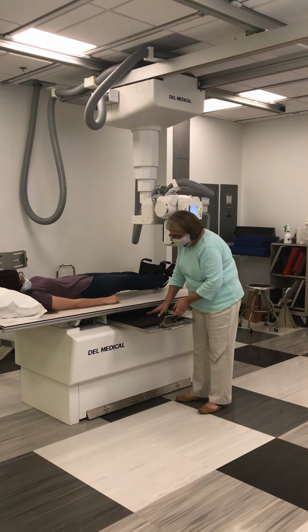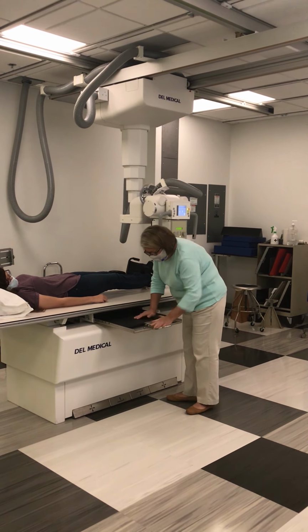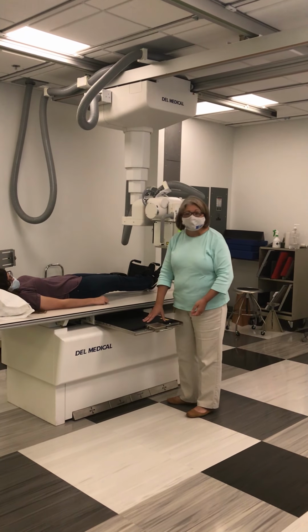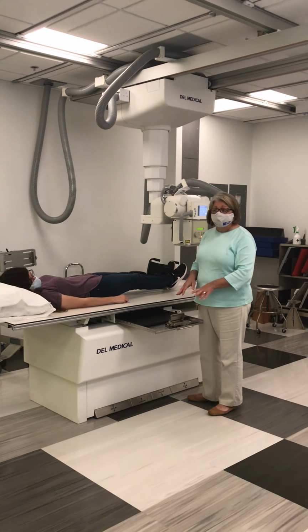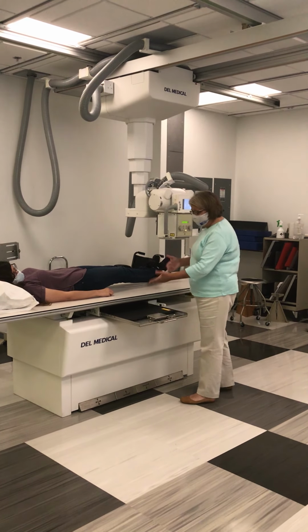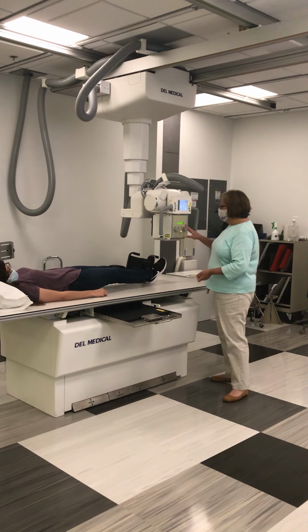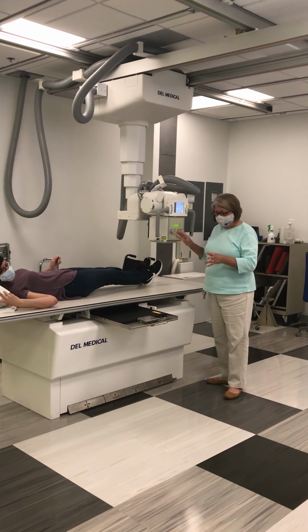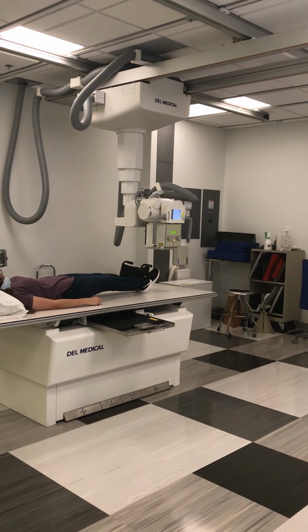Some people get in a hurry, come over here, and close the bucky tray with the image receptor still moving around. If you do that, the problem is you're not going to have your image receptor centered to your central ray once you close the bucky tray. You're also not going to get any accurate readouts for your SID or collimation size. So we have our image receptor placed correctly.